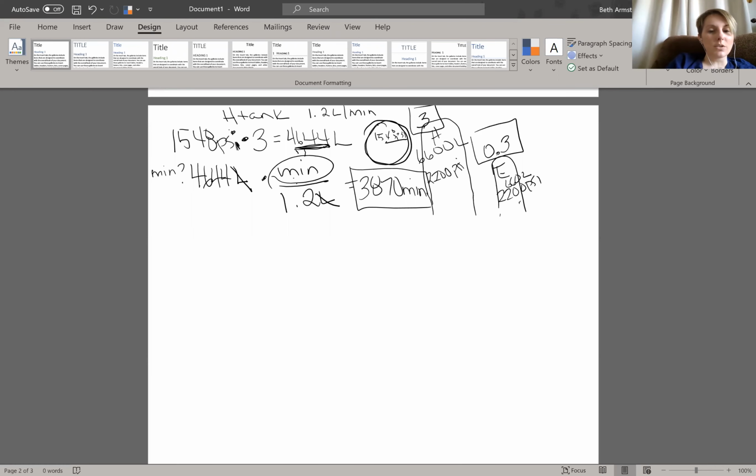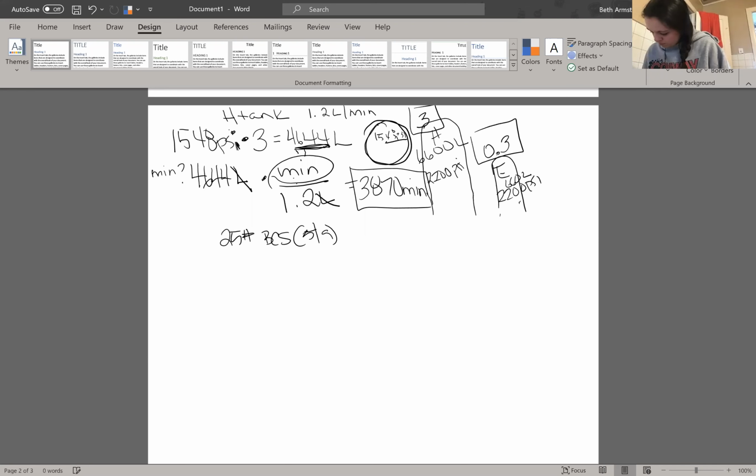Awesome. So say we have a 25-pound patient for surgery, and we'll just give a body condition score too, because why not? Let's see, 5 out of 9. And we need to figure out their oxygen flow rate and bag size. So we need to do O2 flow and bag size.